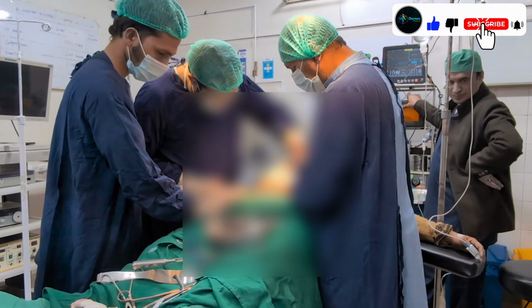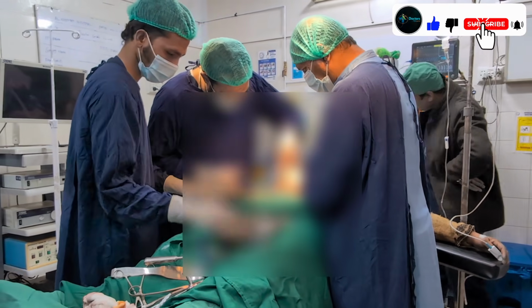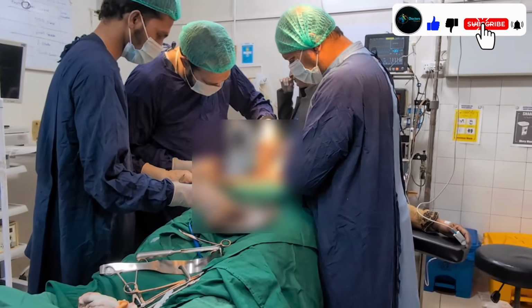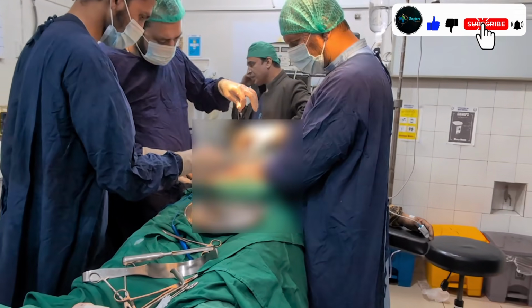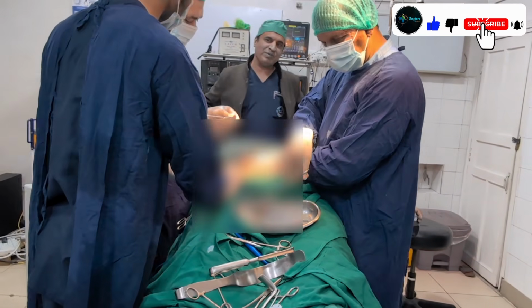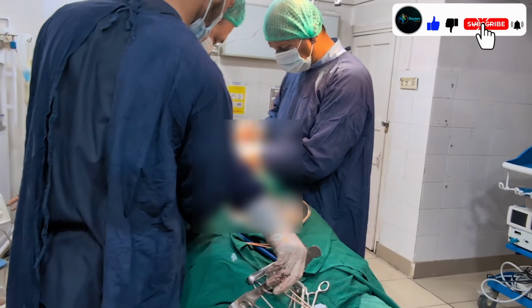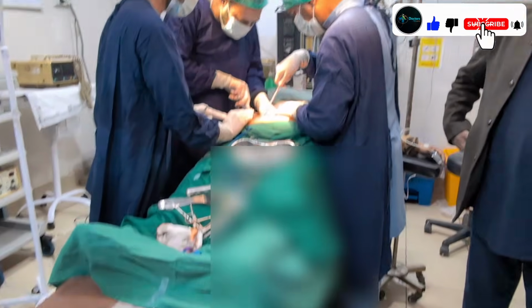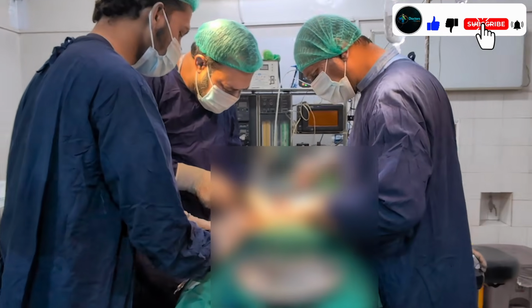Oh my god, as you can see, it has turned completely black. This is a very large ovarian cyst. That is why the patient was in so much pain. It is hard to imagine how the patient tolerated this pain for so long. The ultrasound report did not mention this cyst at all. In such cases, a CT scan should always be done to clearly see what is happening inside the body.